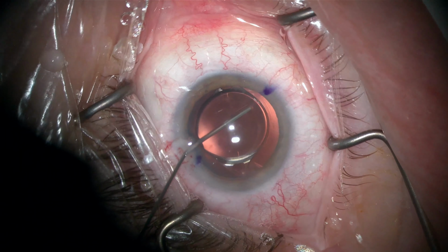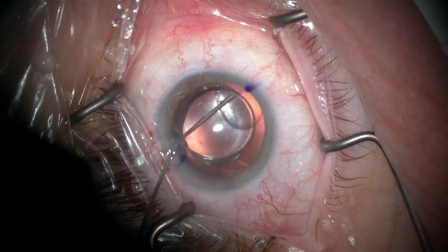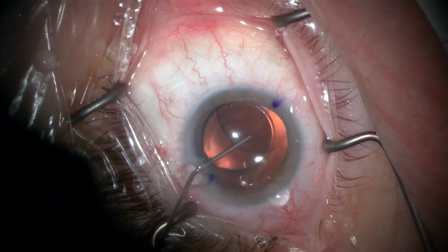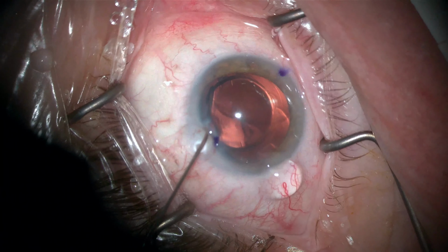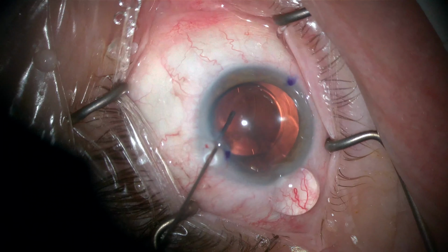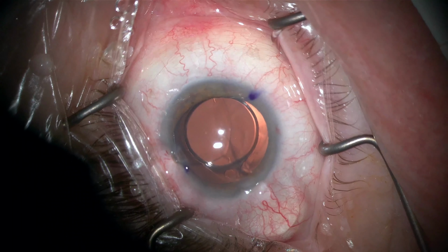Next, a cohesive viscoelastic was used to fill the capsular bag and really viscodissect the haptics out of the capsular fornix. And again, since this was about 3 weeks post-operatively, the haptics became free quite easily.